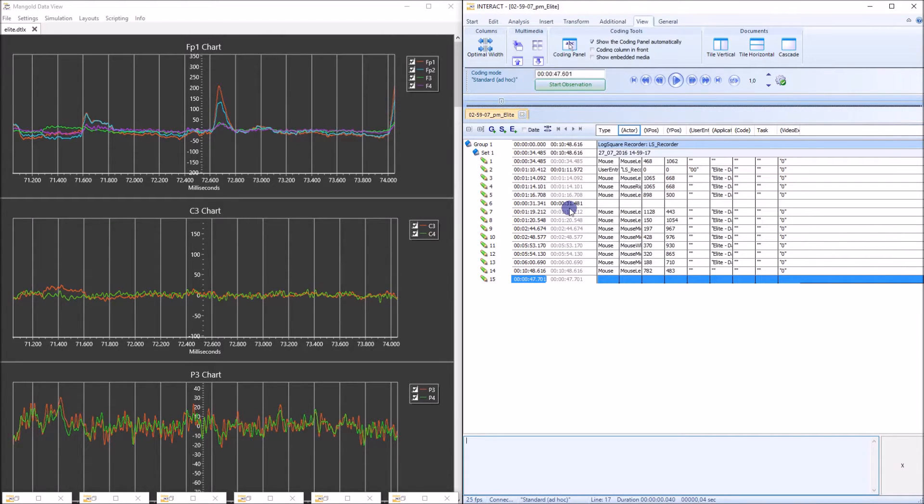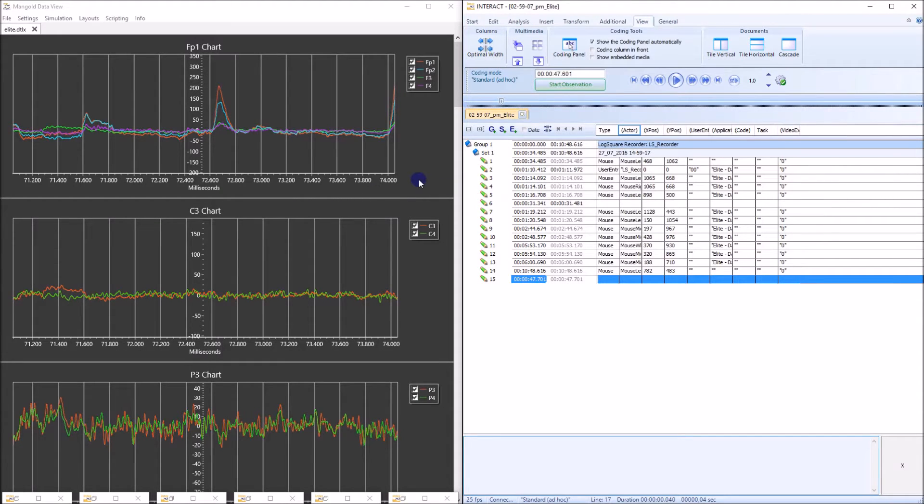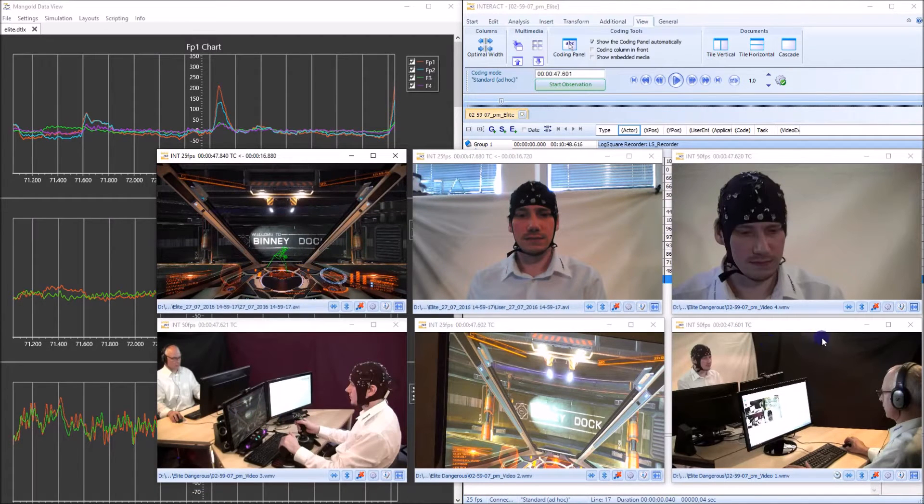On the left hand side you see Mangold Data View and on the right hand side you see Mangold INTERACT. Now they both communicate with each other and if I open the videos then you see those are the videos that were recorded through VideoSync Pro.